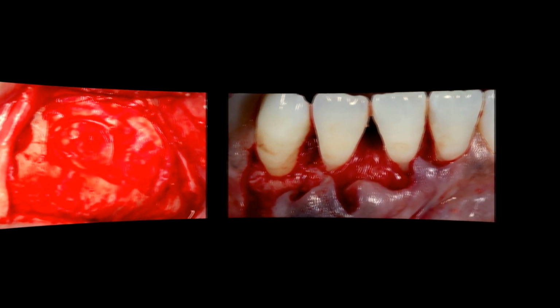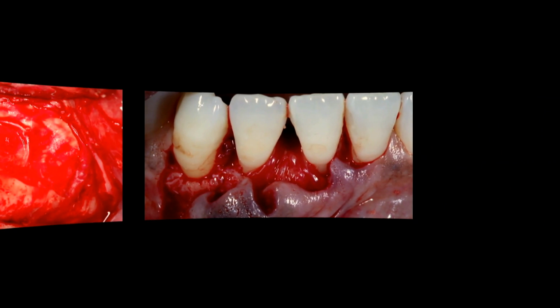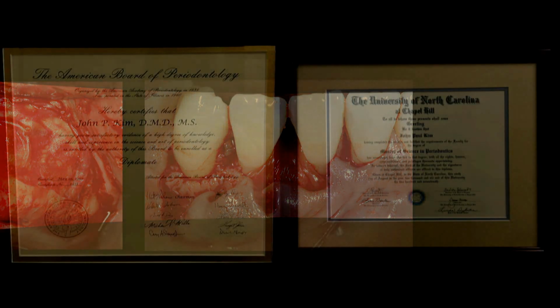And then we are at a perio meeting, so we'll talk a little bit about GTR here. And probably my favorite use for BioXclude, because how many times have you tried to use a collagen membrane and to shape that so it fits interproximally between the teeth? It's very tough. It wants to bunch up on itself. So using it for guided tissue regeneration to me is one of the ultimate uses of BioXclude.